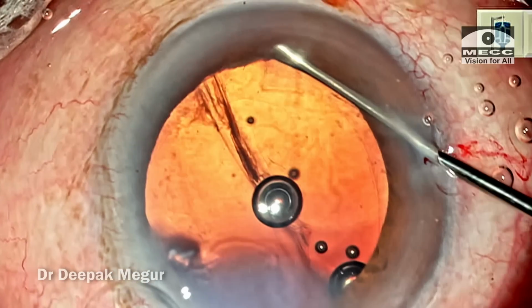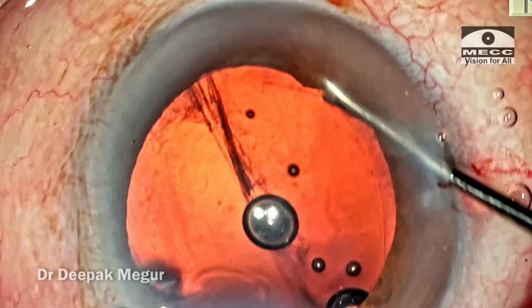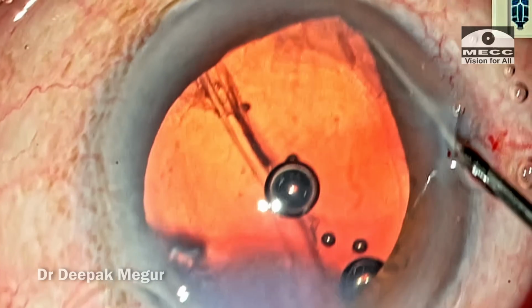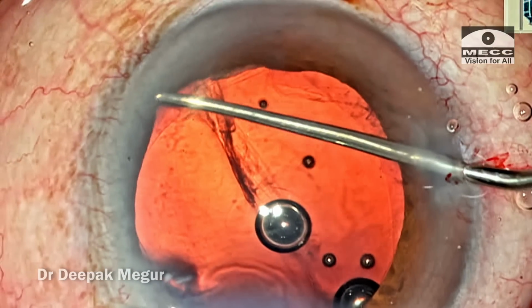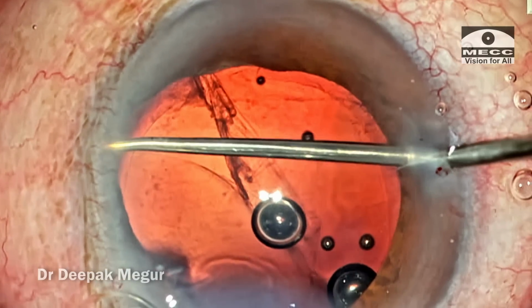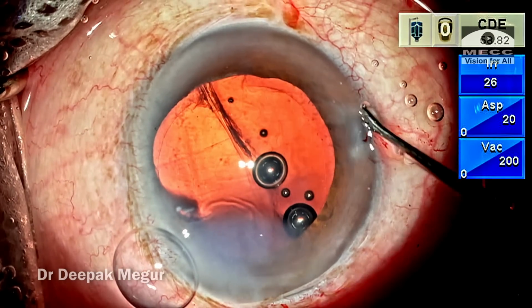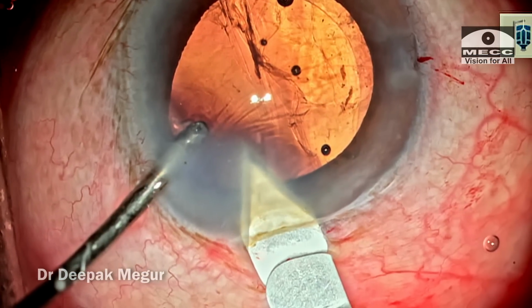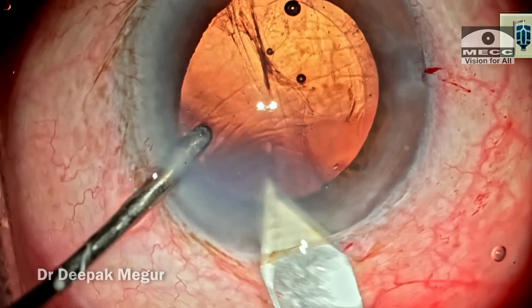So I'm using a Y hook to just retract the iris. I'm trying to visualize and see, is there enough anterior capsular support for me to venture putting the lens in the sulcus. I thought there is a reasonable amount of support with the anterior capsule, so I thought let me go ahead. Time to implant the lens. The incision is extended a bit so that the cartridge can be negotiated easily.